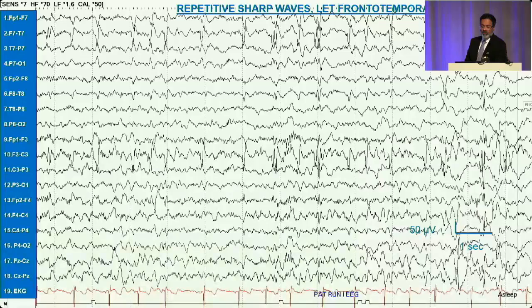All right, we're going to finish with an EEG seizure. So this is a definition of an EEG seizure, something that evolves in time, space, distribution, and frequency. Okay, time, space, distribution, and frequency. So the first page of this EEG seizure shows you a series of repetitive sharp waves, occurring at a theta delta frequency.